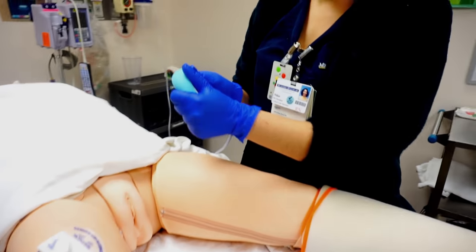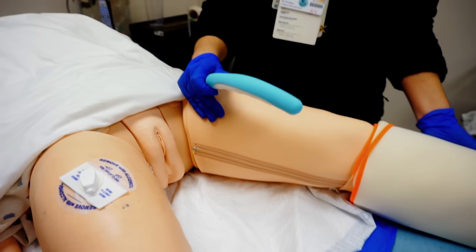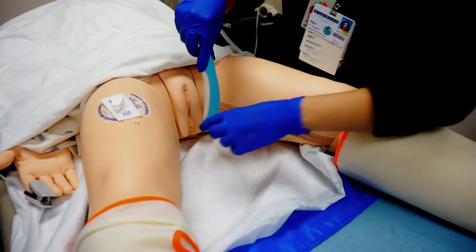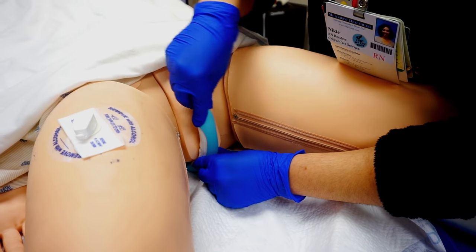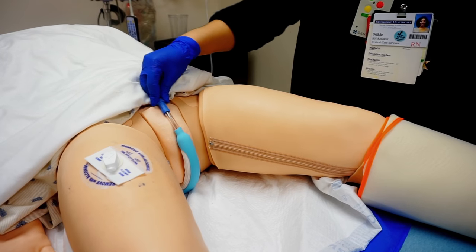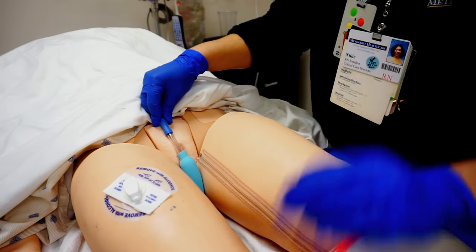If needed, the Purewick can be bent to fit the patient's anatomy better. If the patient is able to, ask them to open their legs; if not, get another nurse to help. This is going to be placed between the gluteal muscles, then it will lay right against the patient and rest against the pubic bone. Once the Purewick is placed, close her legs and it will stay in place.